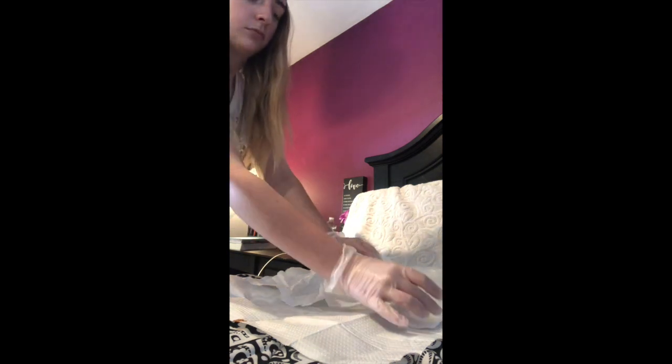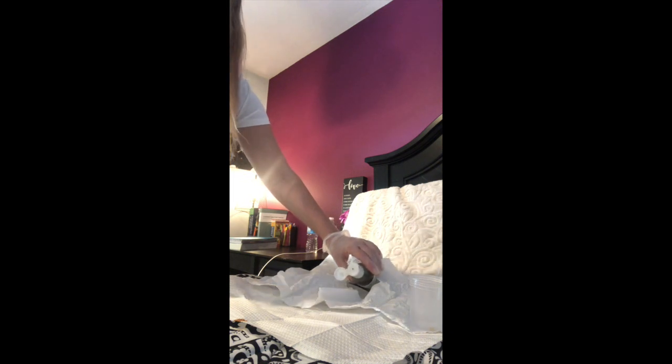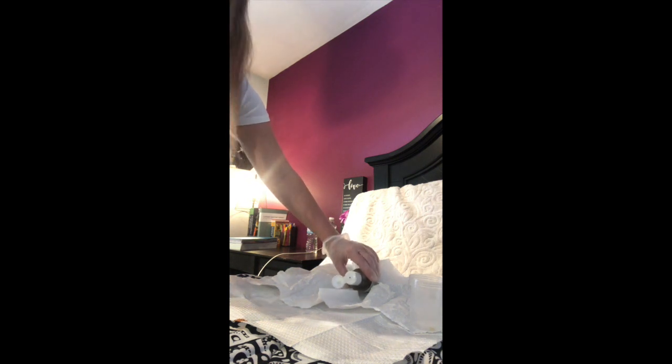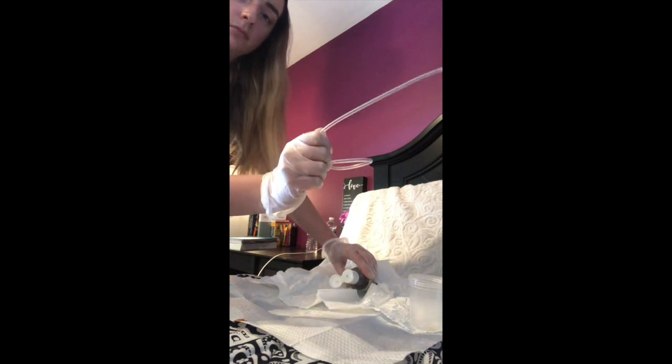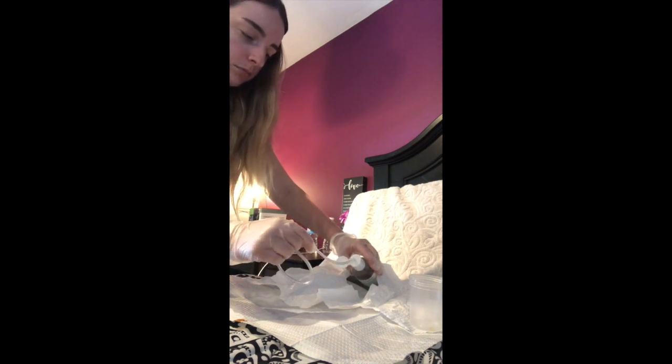Once the urine starts to flow out of the catheter, I'm going to stop advancing with a straight catheter. But if I were to use an indwelling catheter, I would advance it to the bifurcation. At this point, I'm going to allow the bladder to empty fully and collect a urine specimen if necessary. Then I'm going to secure my catheter if it's an indwelling catheter. If it's a straight catheter, which I'm using in this video, when the urine stops flowing, I'm going to withdraw the catheter slowly and smoothly until removed.